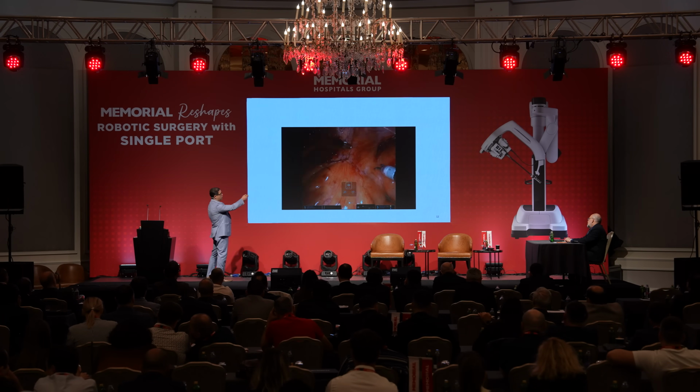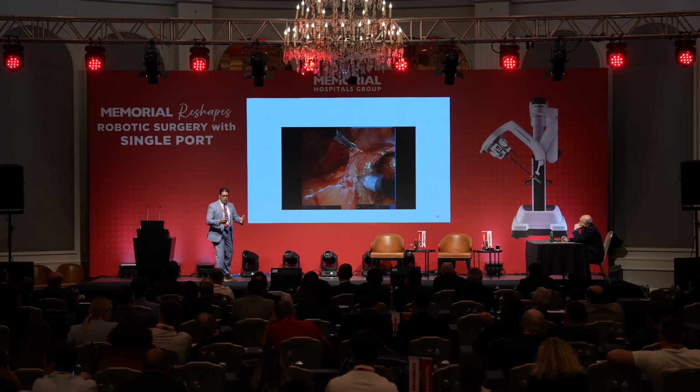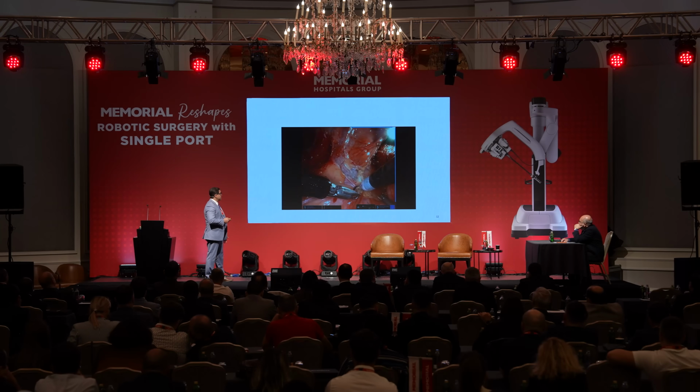You can see now I'm recording myself from the bottom there to see what mistakes I'm making and how I'm moving my arms. I'm learning from my own mistakes, and I'm going to show you that part. And then I'm finishing the dissection completely here.